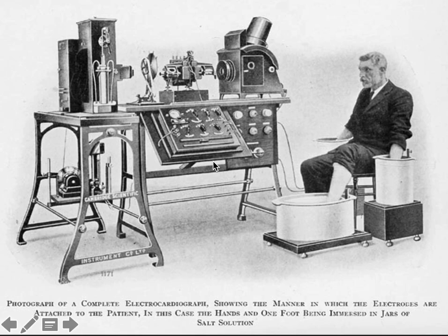How amazing, isn't it? Look at the way we have come from there to the digital ECG machines today. But still, the principle remains the same. The working of the galvanometer remains the same. Everything is the same, except the instrument has become more sophisticated. The basic thing we learn today about the bipolar limb leads is exactly the same as how it used to work in those days, 120 years ago.